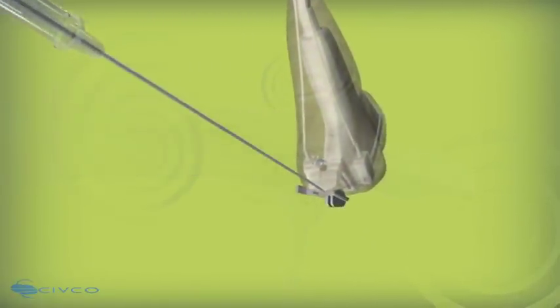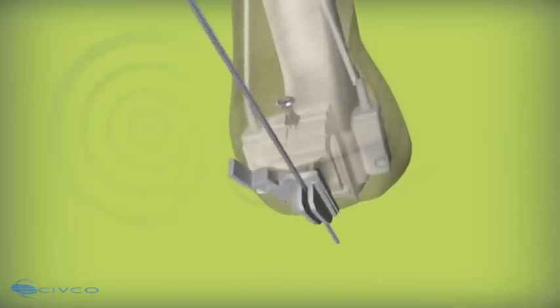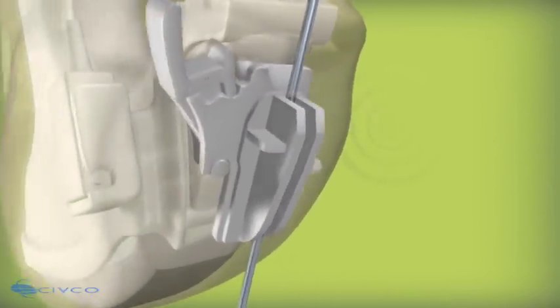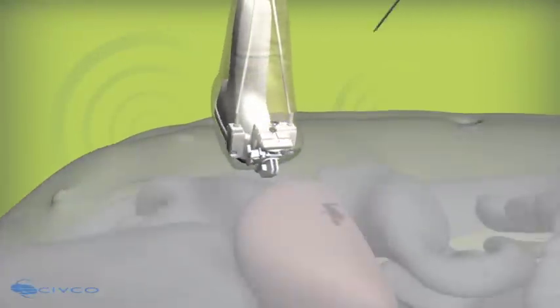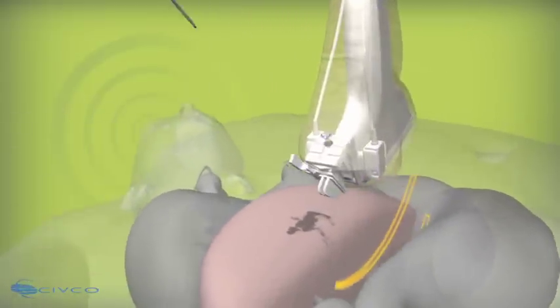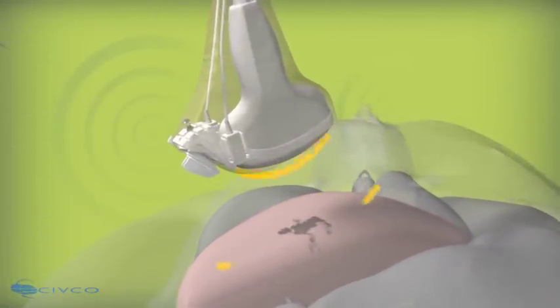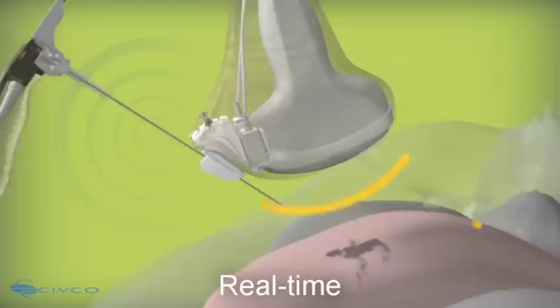Finally, perform the puncture using the ultrasound probe assembly and the E-Trax needle. E-Trax allows you to track the tip of the needle in the scan plane, allowing clinicians to visualize the necessary patient anatomy, as well as the position of the needle tip in real-time.